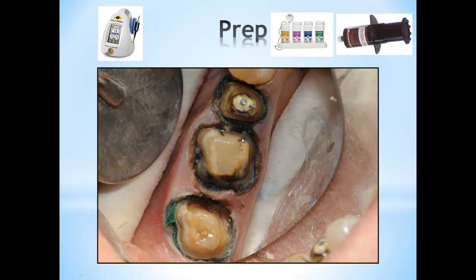We have a lot of discussions about whether it discolors the restoration, or any kind of side effects. But again, I'm sure that I'm using microabrasion when I clean my preparation, trying to remove all the ViscoStat residue wherever it's going to be left. But I want to make sure I control the bleeding.